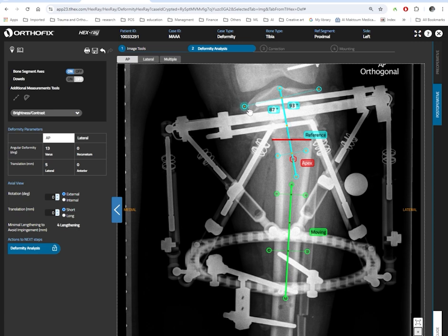This is almost correct. Okay, this one. Yeah. Okay. So this is the shaft line, surface line, and they have the angle here with this red diamond.